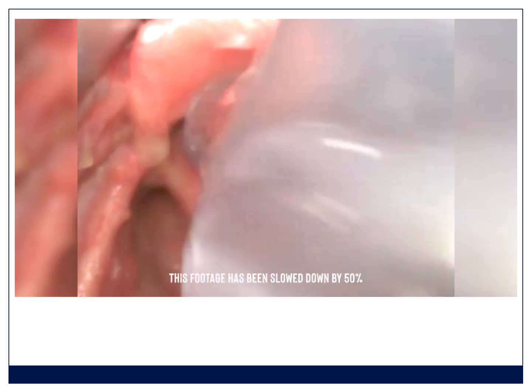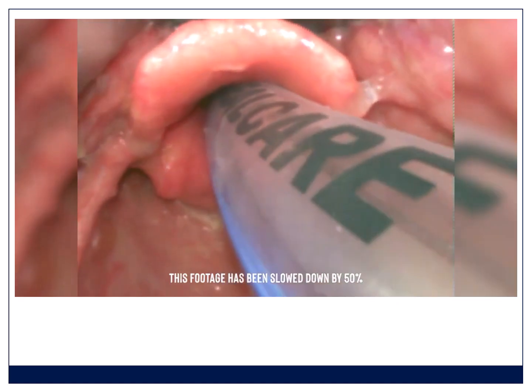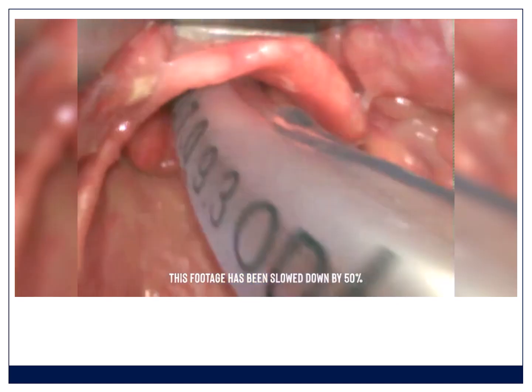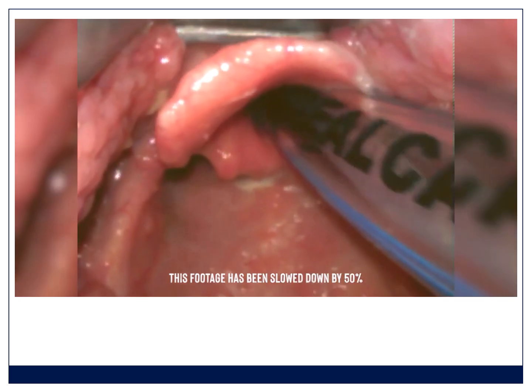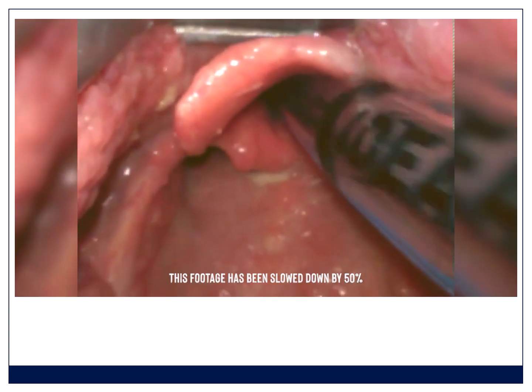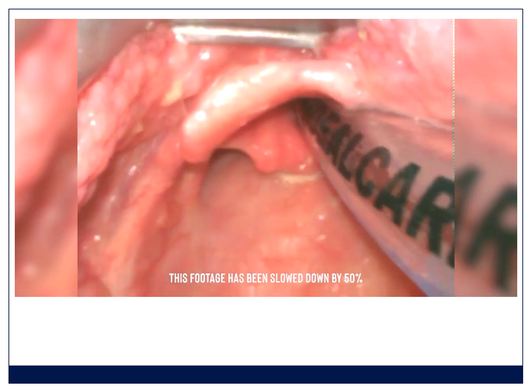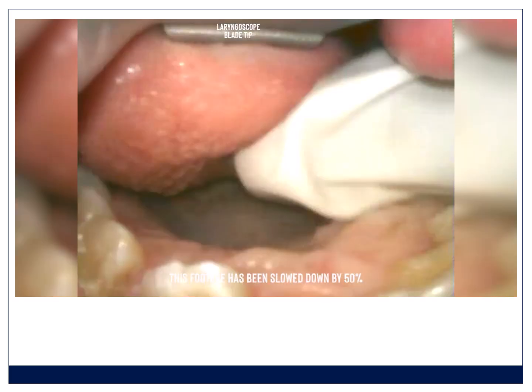The tube is now coming in. You watch it go through the vocal cords, and then what we all do when we're doing it for the first time, we push it too far. So when we've got difficult airways or we're nervous, we stick tubes too deeply. So now you need to make sure you haven't pushed it too deeply. And there is the second line. That's one way of deciding on depth. And then we have the tube at the right depth. So that's basically laryngoscopy.